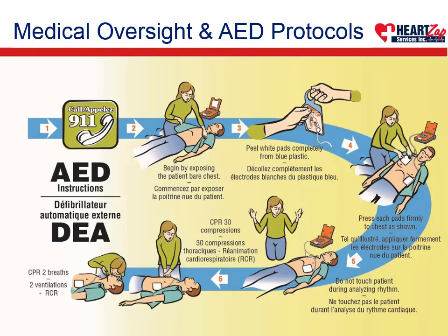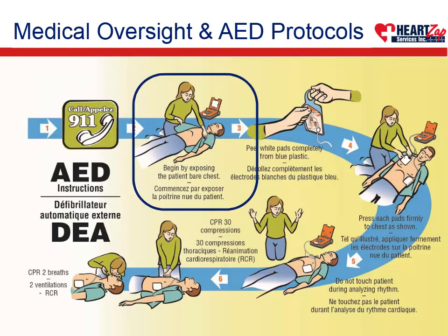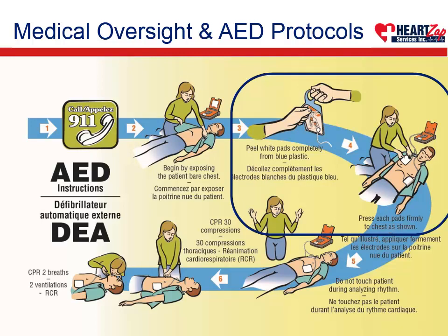AEDs are designed to determine the best treatment for a casualty. If the casualty is not breathing or is gasping or has labored breathing, the AED should be activated, and if safe, the electrode should be attached to the casualty's bare chest.